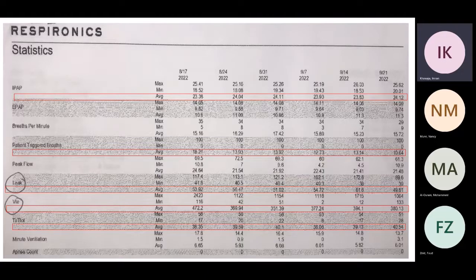What if the patient has a neuromuscular disease? Let's say you said that in this prescription the backup respiratory rate is 12, and this number across the board is about 50%. You want the machine to help them more. What settings do you need to change?